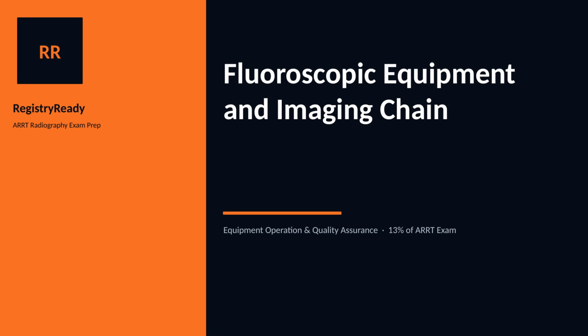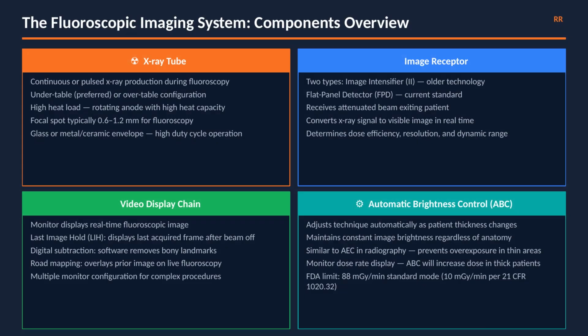safe practice. Today, we cover the full fluoroscopic system, the image intensifier in detail, flat panel detectors, dose rates and FDA regulations, magnification modes, digital viewing systems, C-arm design, and image intensifier performance specifications. 14 minutes. Four major components work together in every fluoroscopic system.